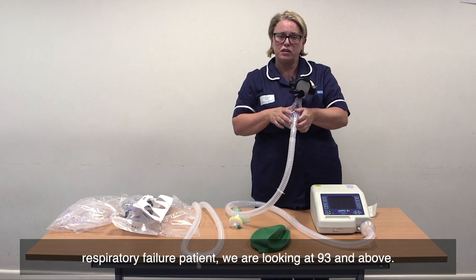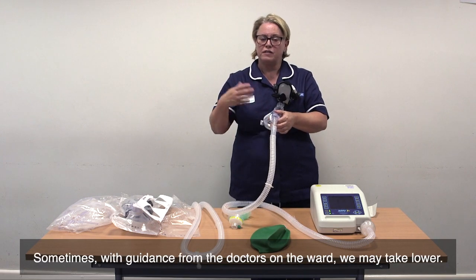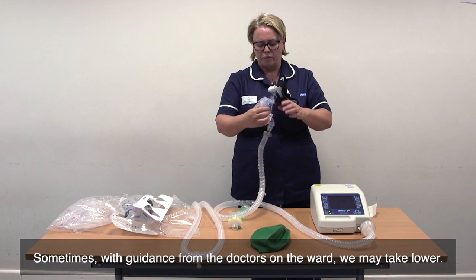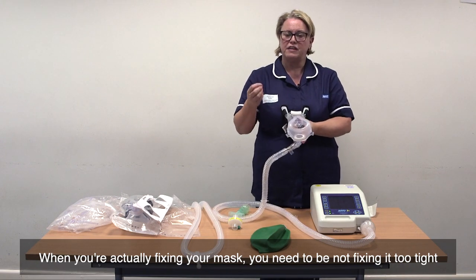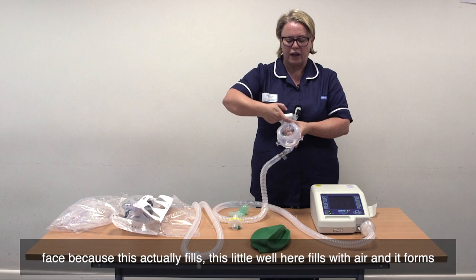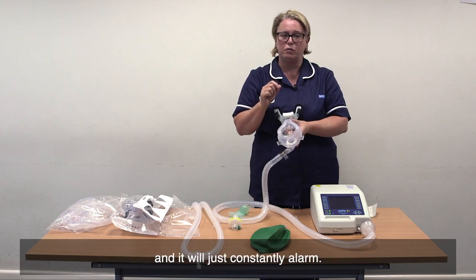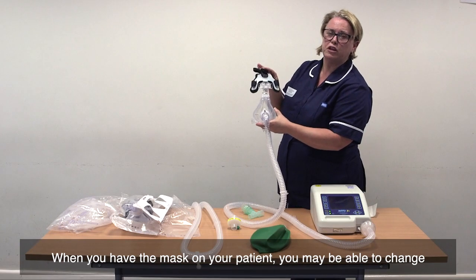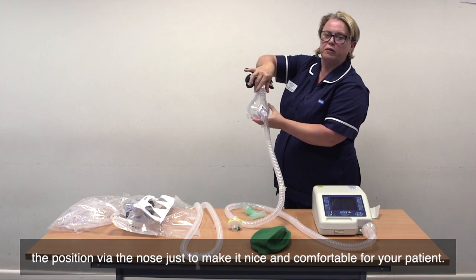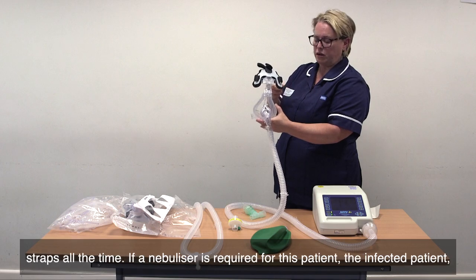In the type 1 respiratory failure patient, we are looking at 93% and above. Sometimes, with guidance from the doctors on the ward, we may take lower. When you're actually fixing your mask, you need to be not fixing it too tight because your patient won't tolerate it. It needs to be nice and loose on the face, because this little well here fills with air and forms a seal on the face. If you put it on too tight, it will not seal and will just constantly alarm. You may be able to adjust the position via the nose to make it comfortable for your patient. You don't need to be changing the straps and tightening them all the time.